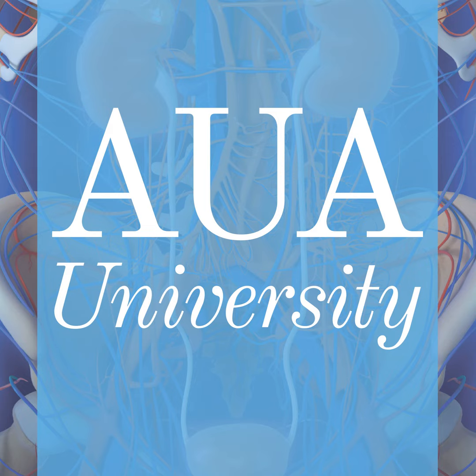So this is an interesting study also for patients who had biochemical recurrence, again, only after radical prostatectomy, where they looked at the salvage clinical target volumes regarding salvage radiation to determine how much we would have missed with the PET scan. Inclusion was PSA 0.2, 6 weeks after RP or later, and they confirmed a prostate bed recurrence described on PSMA. Median time from RP to the PET was 77 months, so over 5 years. So these were fairly favorable disease here.